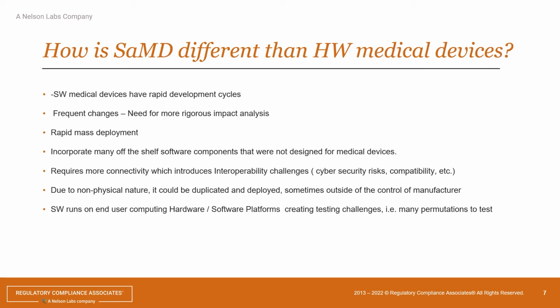So there's interoperability. When we're talking about rapid mass deployment, you've got to keep track: I have to interface with this other medical device, and this other medical device. That itself might be a hardware medical device, or it might be another SaMD, and then what are the versions of those? Am I compatible? Am I working?